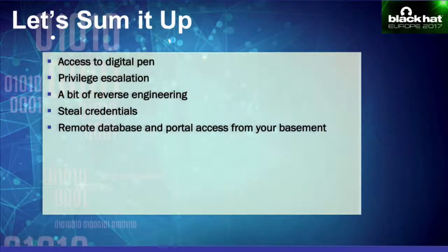To sum it up quickly, we got access to a digital pen. They're really tiny, and hospitals allow people to freely walk in, unlike corporations. So they are usually just exposed on the nurse's desk. If someone wanted, they could just pocket one, because it doesn't really have to be connected to that whole setup to exploit this vulnerability. And then a bit of reverse engineering would allow you to decrypt that configuration file, which gives you access to the database, and then all the data could be accessed remotely.